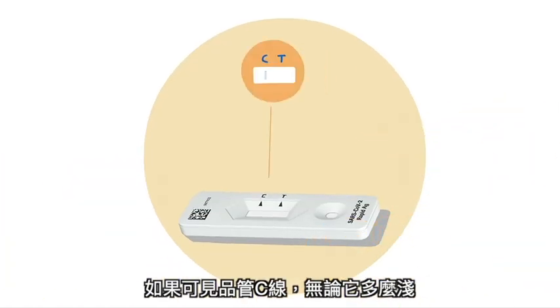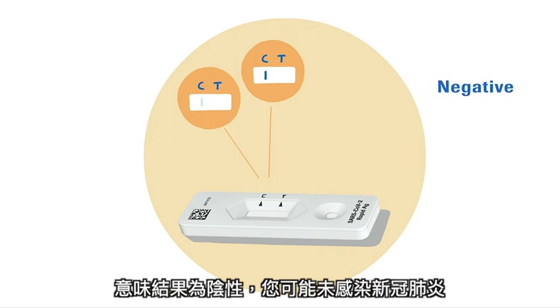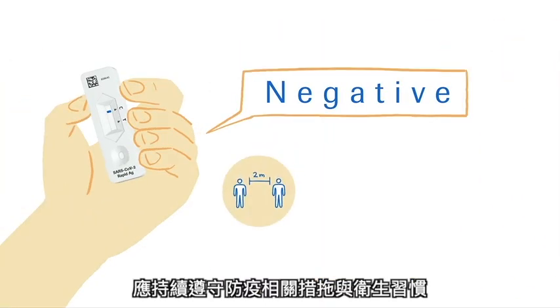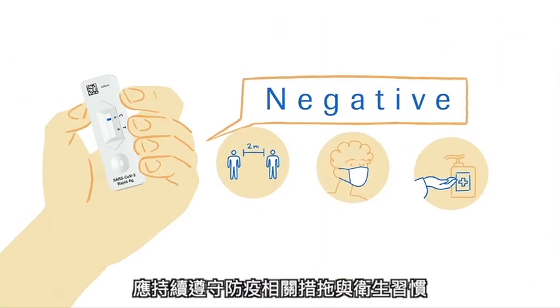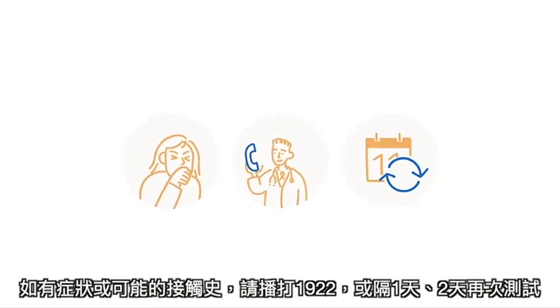If the control line C is visible, regardless of how faint it is, and the test line T is not visible, it means the result is negative — it is unlikely that you have COVID-19. However, even if your test is negative, continue to follow all hygiene and safety measures. If you suspect that you have an infection, you should contact your doctor. You may repeat the test after one to two days, as COVID-19 cannot be detected with complete accuracy during all stages of an infection.